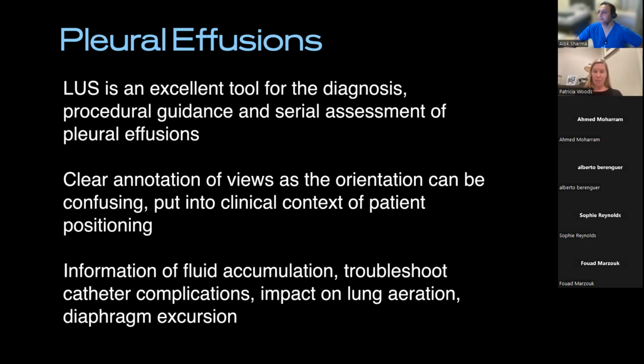But anyway, I think lung ultrasound is brilliant when it comes to this. Limitations, yeah, it's messy, and the dressings of intercostal catheters are impacting your views. Certainly a lot of jelly can get in the way, and it can start to lift off Tegaderm and things. So you've got to be really respectful of what's sterile and try to maintain dressing integrity. But I find it extremely helpful, and obviously I'm really happy for others' opinions too.